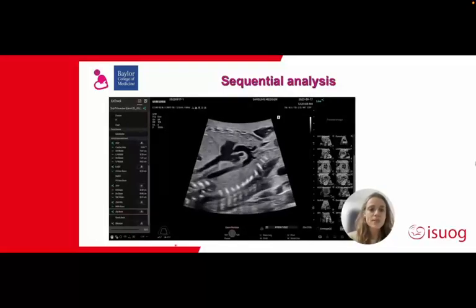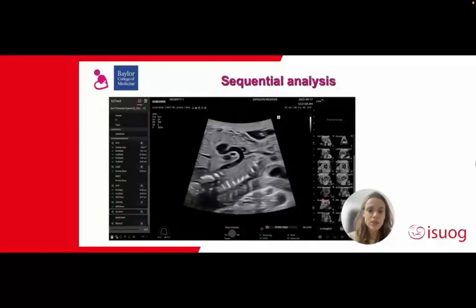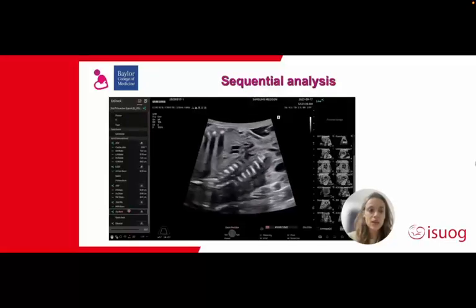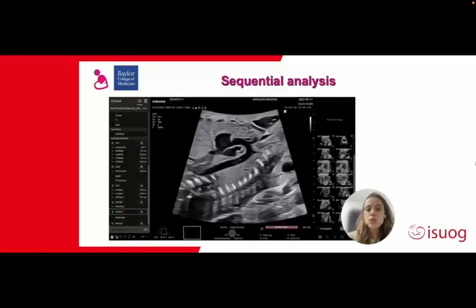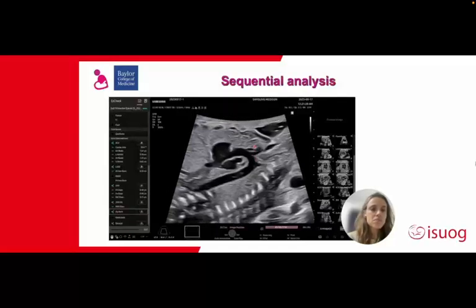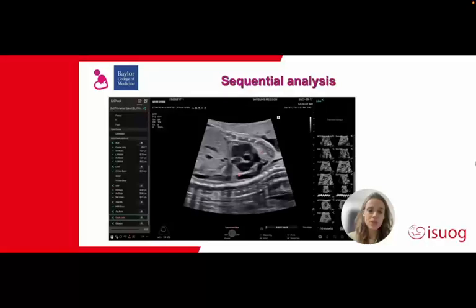You saw there how the bicaval view was checked here on the left-hand side of the screen and collected also in here. Now you will see how the ductal arch will also come as registered and is in here. And if you freeze the image and you just press your label button, the several parts of our aortic arch will be labeled: the ascending aorta, the branches, and the descending aorta. And if we just say measure, all the specific parts of that structure will again be measured.